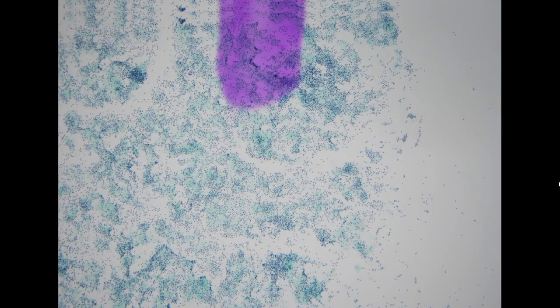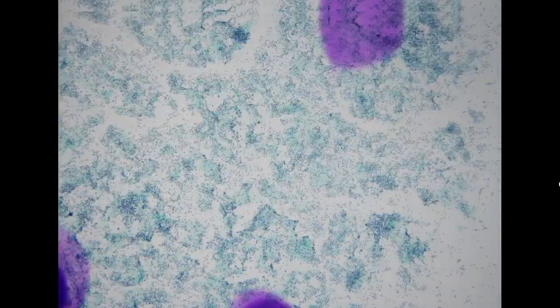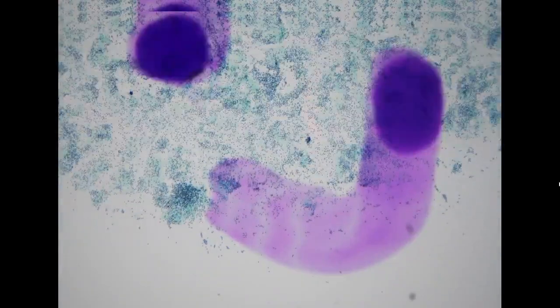Then we move to body fluid specimens. The first one is coming from an ascites specimen of a 64-year-old female. According to the history, the patient has been proven to have gastric cancer and liver metastasis. On low power for this body fluid specimen, we noticed scattered tight clusters of cells with hyperchromasia. These are what we call the second population.